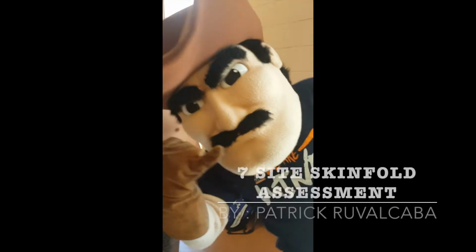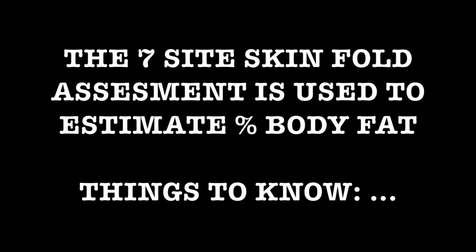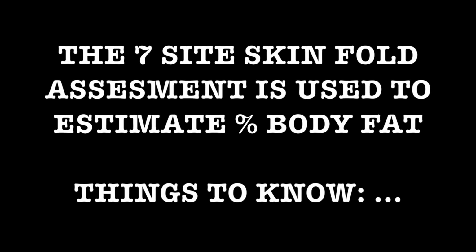Hi, my name is Patrick, and today PayDirt Pete and I will be showing you the 7-site skinfold assessment. The 7-site skinfold assessment is used to determine the amount of subcutaneous fat located directly below our skin.